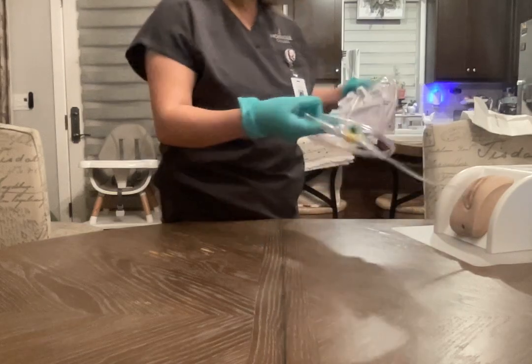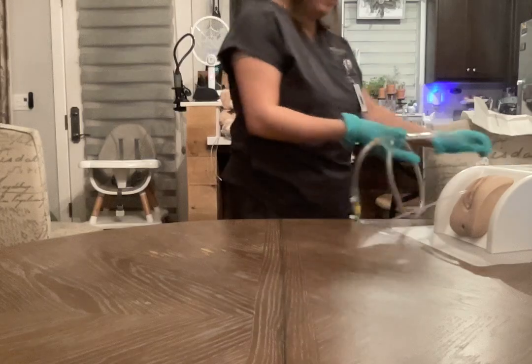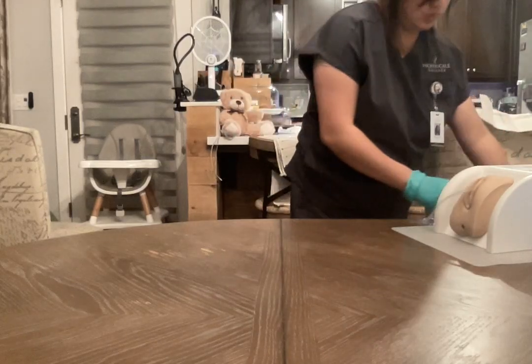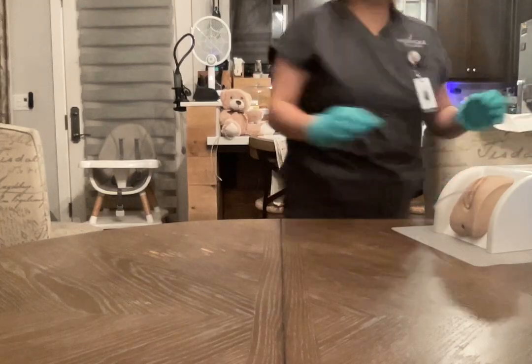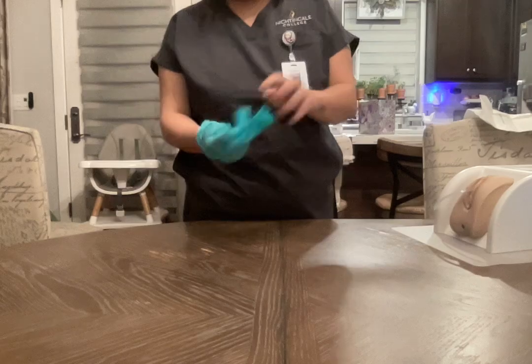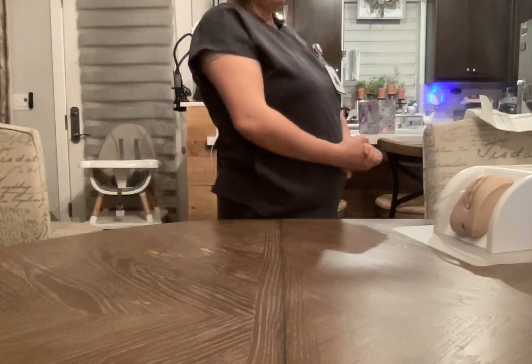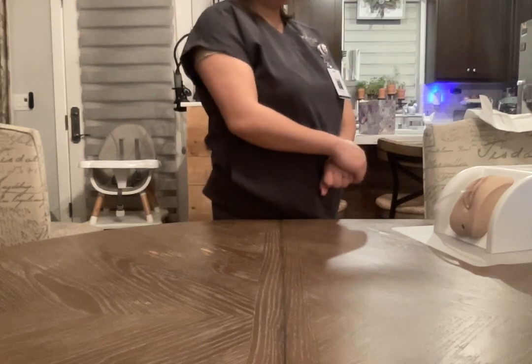Okay, and then I'll hang the catheter bag below the bed. I'm going to remove my gloves and perform hand hygiene. And then, are you comfortable? Okay, so I'm gonna cover the patient back up. And then please use the call light if you need anything.